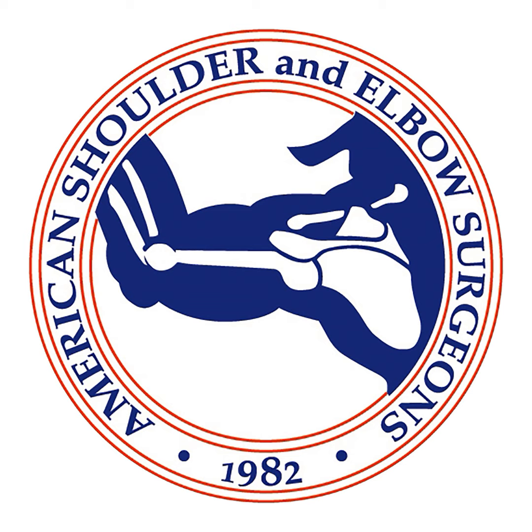So I think the big thing for stemless that we've seen, and I've seen in my practice, is that if you do a stemless, paying close attention to how much and in what direction you dial the humeral head down in relation to the tuberosity is critical. We've all learned that the anatomical shoulder in the end is a soft tissue operation. And with stemless, you can get yourself in trouble by placing the implant a little too high on the humeral cut and not being cognizant of the cuff in relation to the tuberosity.